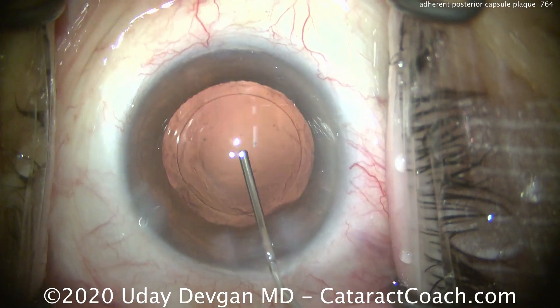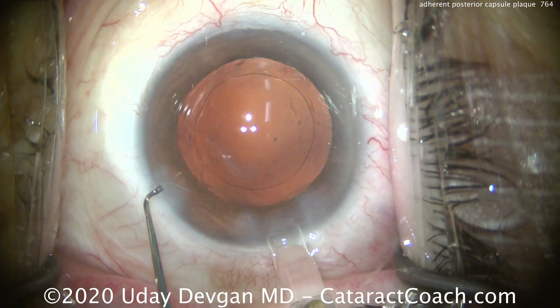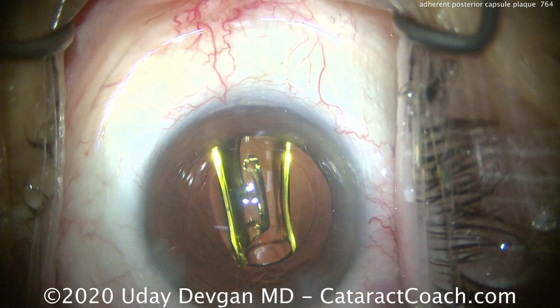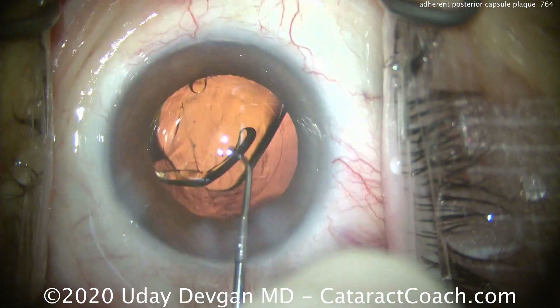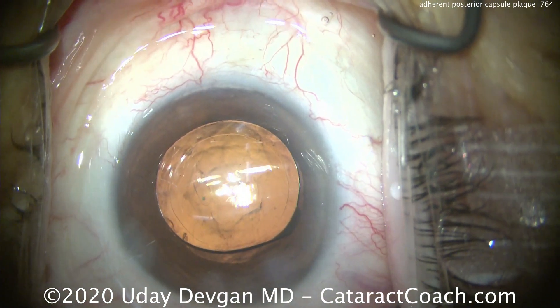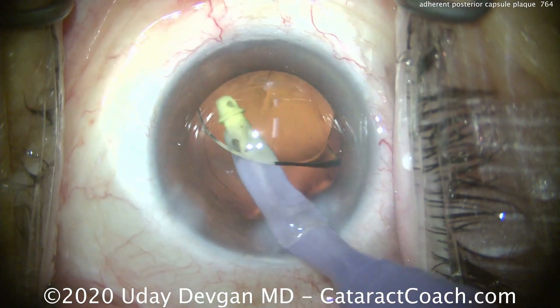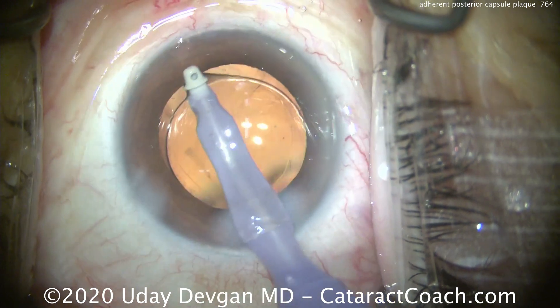I tried to remove it, but I don't want to damage the capsule. Remember, what's the delta — the before and after for this patient's vision? The before vision is counting fingers at three feet. With this IOL giving a plano outcome, the post-op result is going to be 20/20 or close to it. That's an amazing outcome. And if there's a little bit of opacity on that capsule, that's no problem — we can always do a YAG laser capsulotomy. I'll try one more time to remove these opacities by going under the IOL optic with the IA probe, gently rubbing in that area, trying to get as much of that lens material off the posterior capsule — but it's just not going to come off. That's okay, we'll leave it.